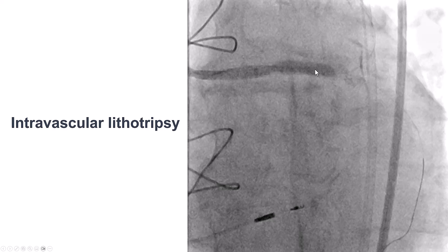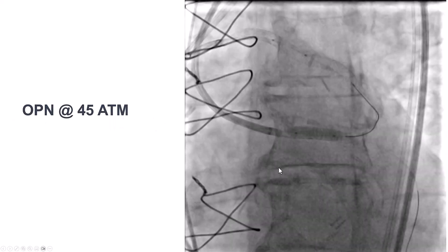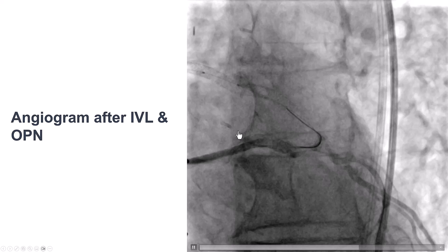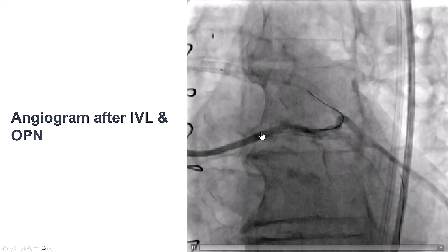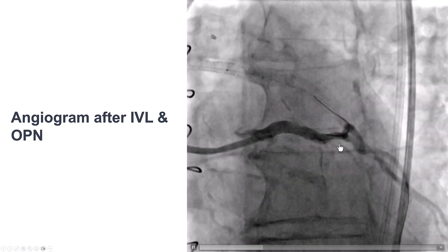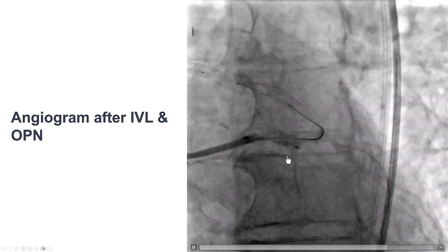We did intravascular lithotripsy, 120 pulses, and the balloon expansion seemed better but was not perfectly expanded. So we ended up using the OPN balloon at 45 atmospheres. Now we seem to have better expansion of the vessel. On the angiogram afterwards, we can see a much better result in the left main with good flow into the Ramus. However, the circumflex doesn't look that great.